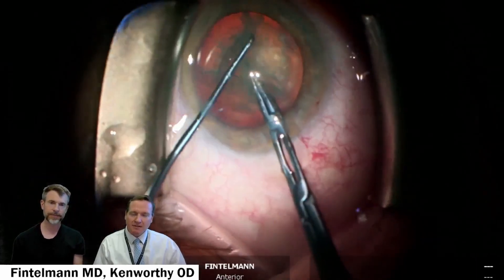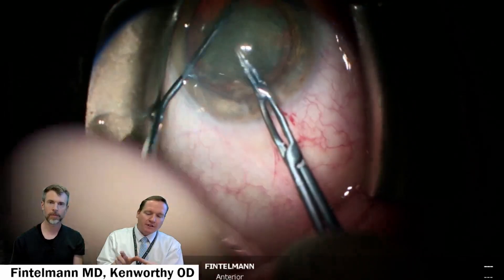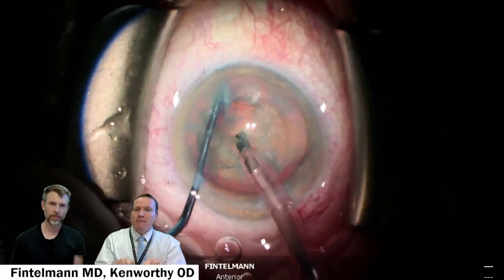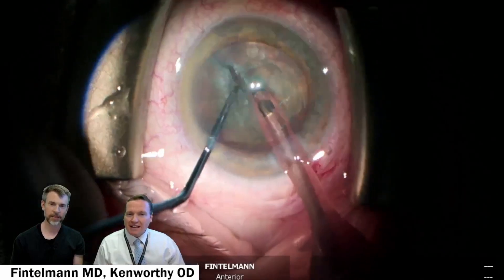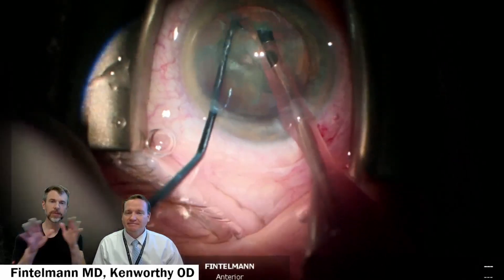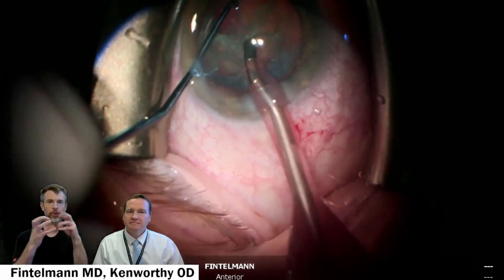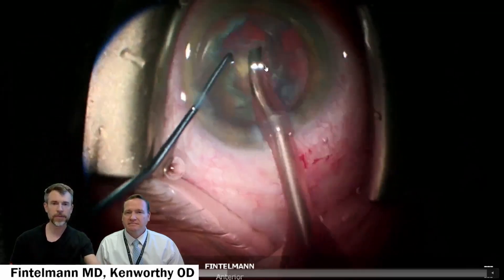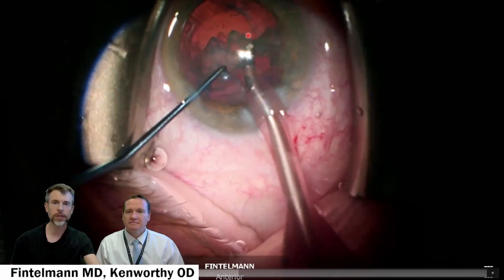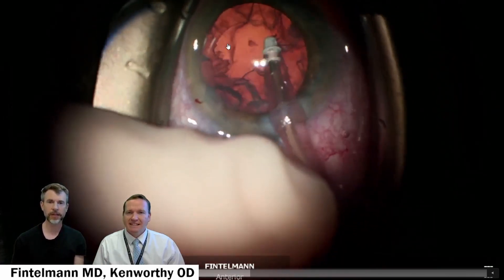This is breaking apart the actual cataract now to get it prepared for the phacoemulsification and pulling it out. The first part was a very thin fluid, a BSS solution — a hydrodissection — and now we're going into more of the manual spinning and rotating of that lens to get it prepared to remove. These little pieces as they come out are broken up by the tip, and then fluid comes out of these side ports, immediately cooling and replacing the volume so there's no compression or decrease in size of the anterior chamber.